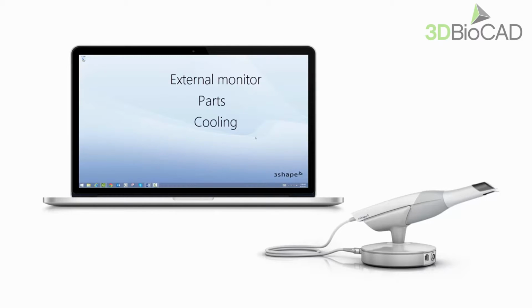Cooling. When scanning and processing, the computer produces a lot of heat. To sustain maximum performance, make sure to have sufficient cooling, otherwise the CPU will slow down. Laptops may be lifted up from the surface to avoid overheating. Battery operation is not recommended due to performance drop.